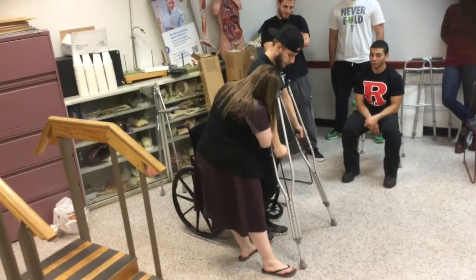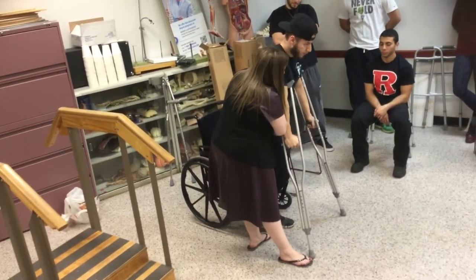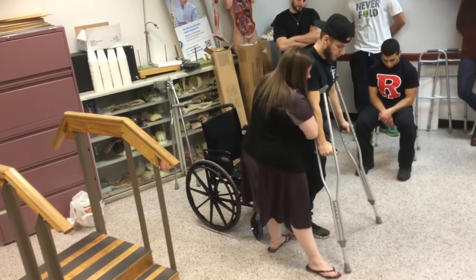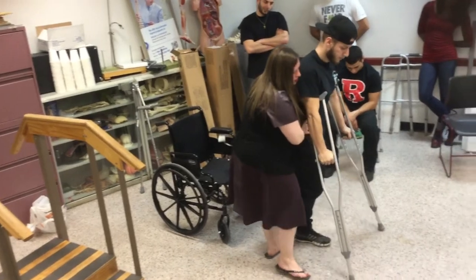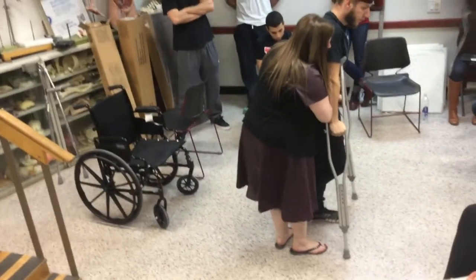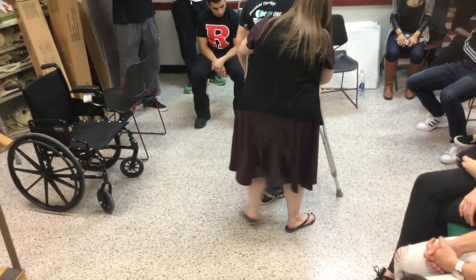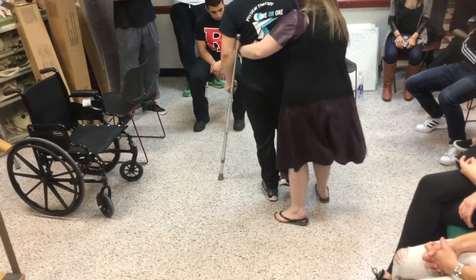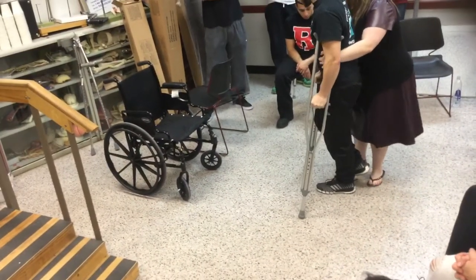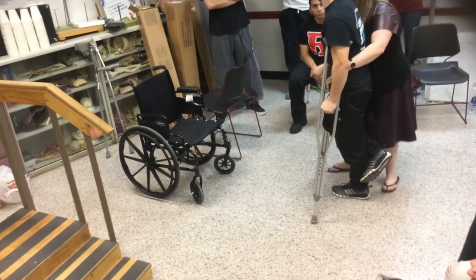You're going to hold the crutches out to the side and a little in front. The leg is up. You're going to hop with the left leg only to meet the crutches. Crutches, hop. Crutches, hop. Crutches, hop. Now we're going to turn towards the left leg. You see how I'm mirroring every move? Because if you don't mirror every move, something's going to happen with crutches. You have to be literally on top of them.